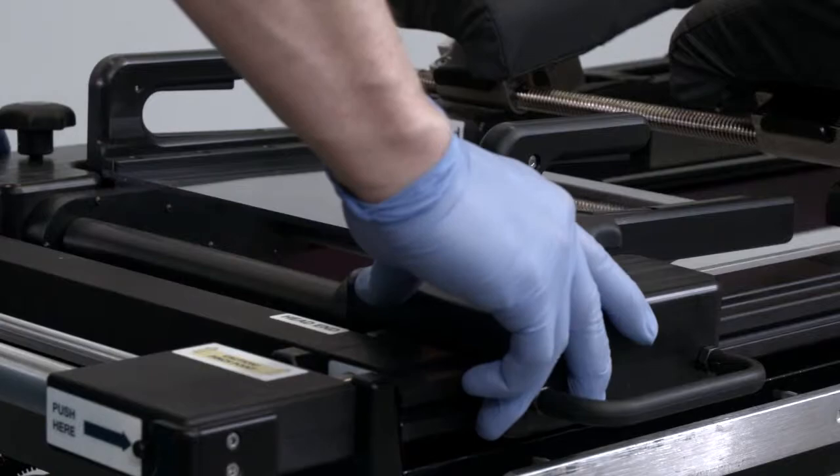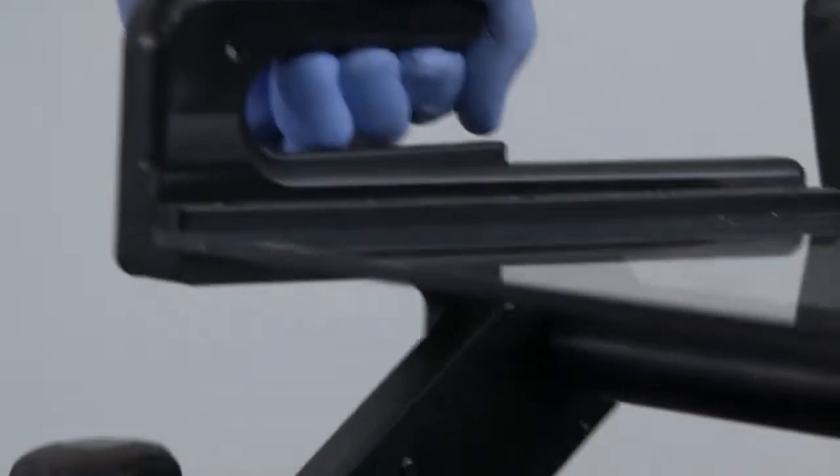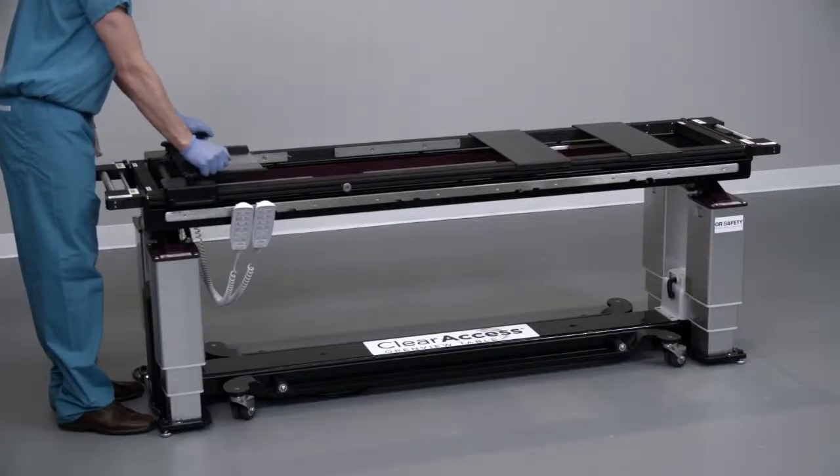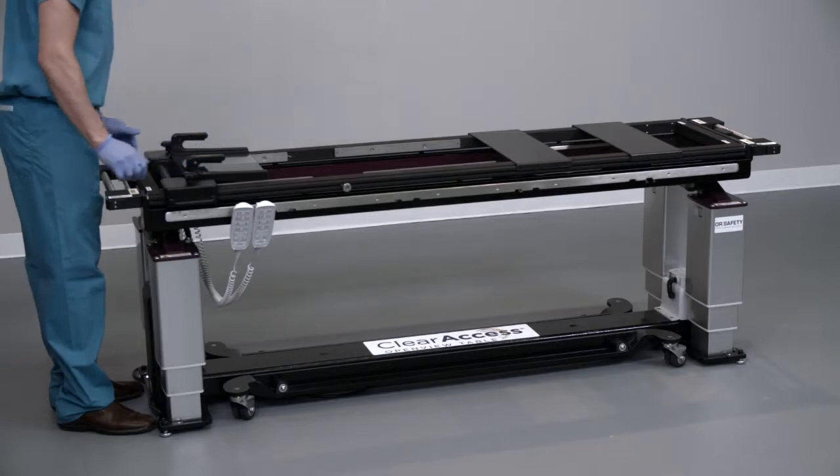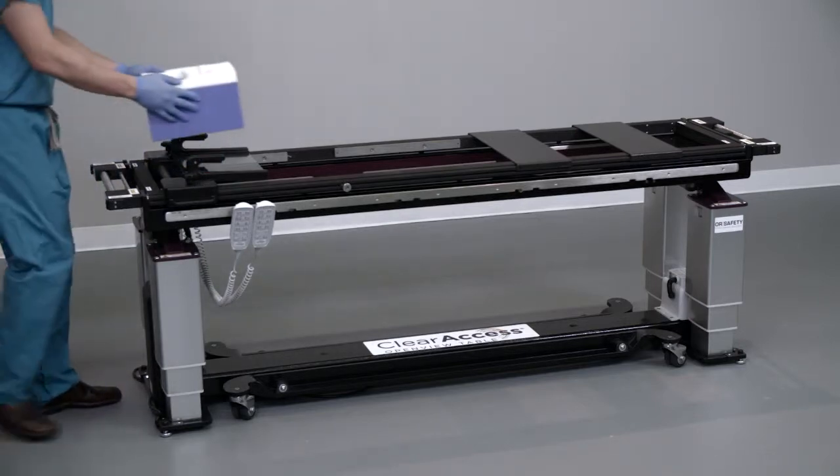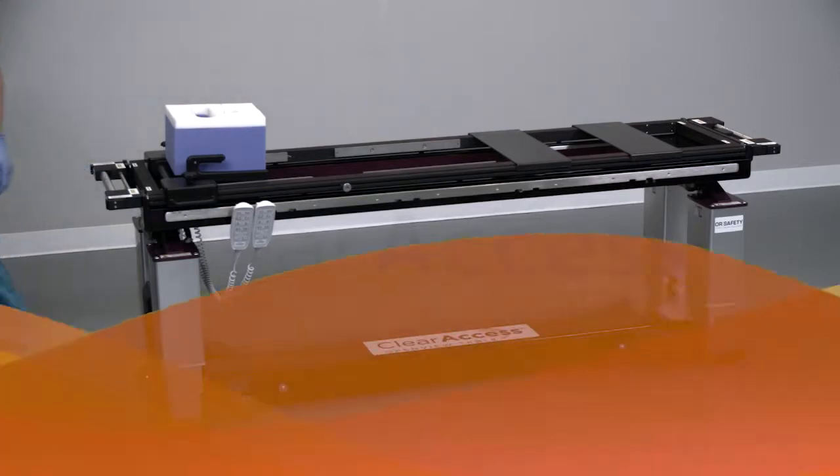Adjust the height and pitch of the support plate by grasping both control handles and squeezing firmly to release the lock before making any adjustments to the support plate. Release the control handles at the desired height and orientation of the support plate to automatically lock it in place. Install the desired face pillow on the support plate. The ClearAccess head support is compatible with the prone view system.